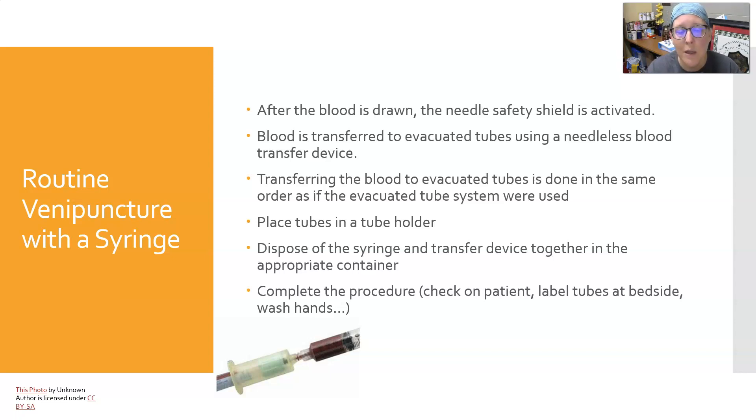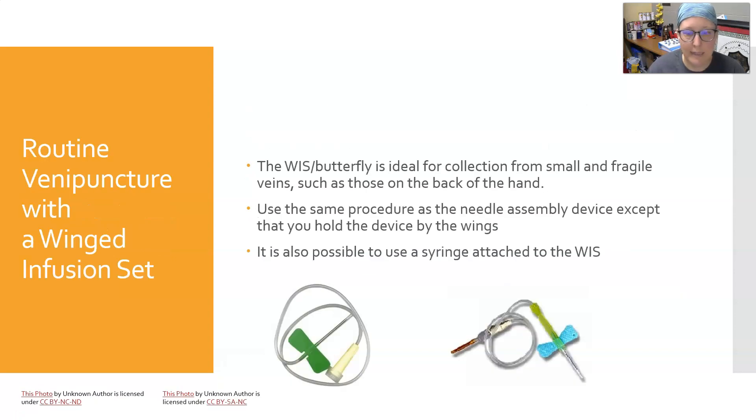Activate the safety device, remove that needle, and use a needleless blood transfer device to transfer the blood to the tubes. It's called a blood transfer device — it does have a small needle inside the hub but it's a safety device. Transfer blood to evacuated tubes in the same order of draw as if you had used the multi-sample evacuated tube system. Place tubes in your tube holder rack or bag, and dispose of the syringe and transfer device together in the appropriate sharps container. Complete the procedure — check on the patient, label the tubes, wash hands, etc.